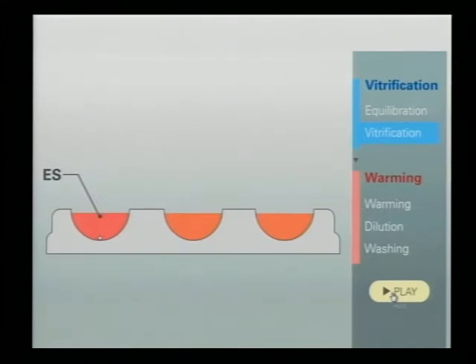If you missed the finishing of this step or if you have no confidence of the recovery of the volume by your observation, then the maximum time of oocyte and the blastocyst is 15 minutes and 12 minutes for four-cell. Normally it takes only eight to nine minutes for human oocytes on average.